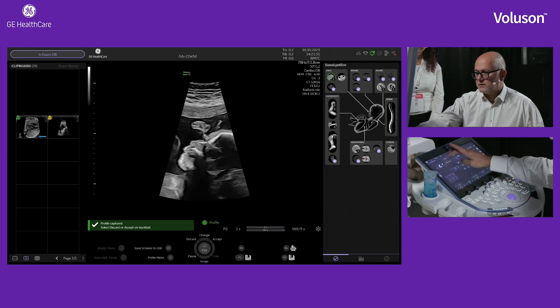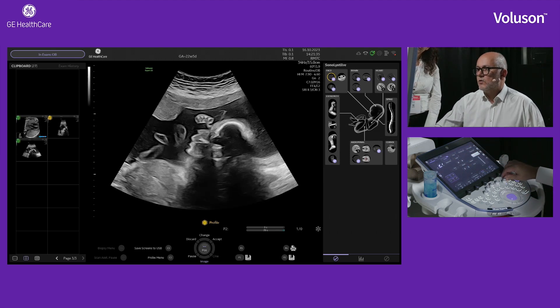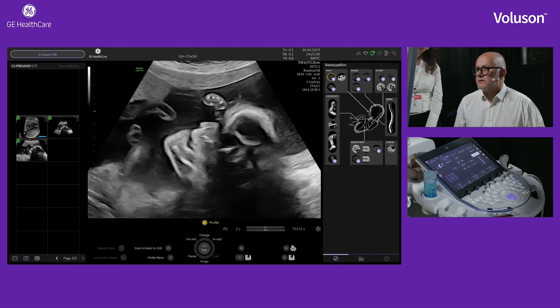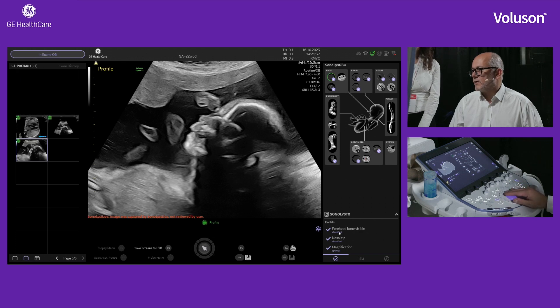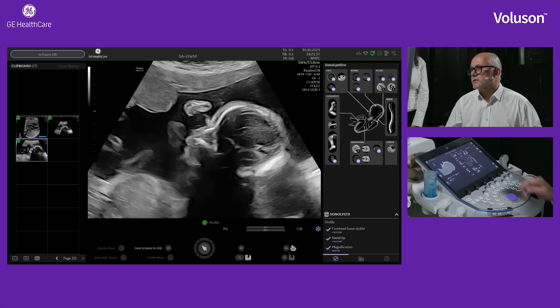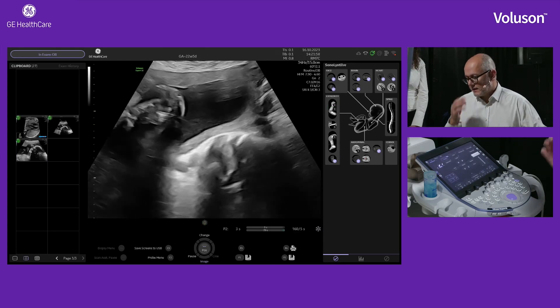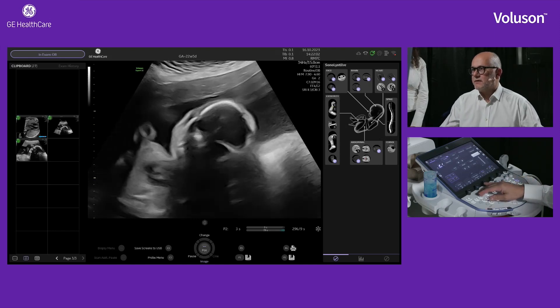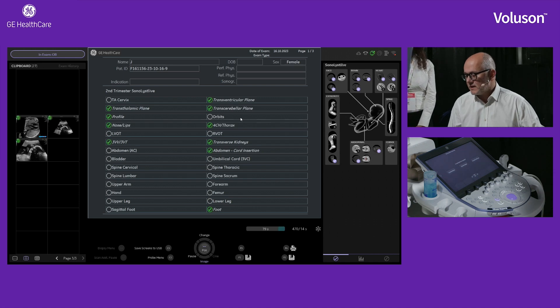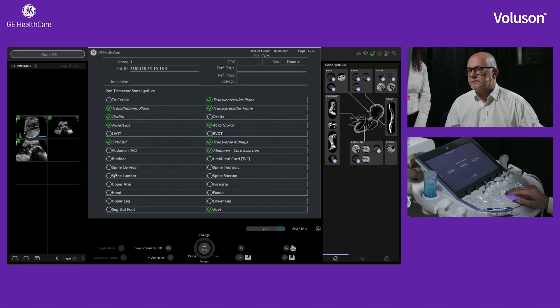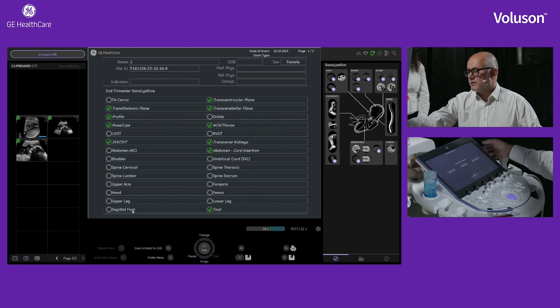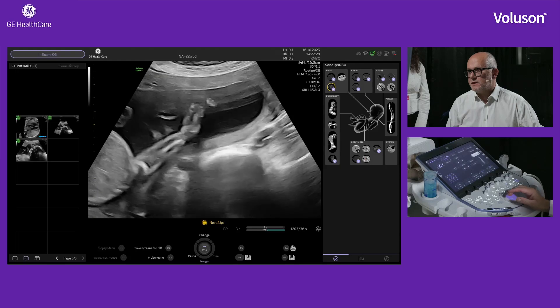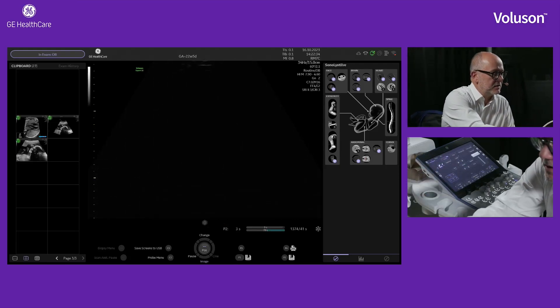You can interact with the system as much or as little as you want — just have it running in the background, or ask quite a lot of it. If I click to end my examination now, I get a summary sheet telling me I haven't finished: I haven't seen any of the spinal views, haven't seen the LVOT, and haven't properly viewed the sagittal view of the foot. It gives me the option to accept and end the exam, or to continue the exam.